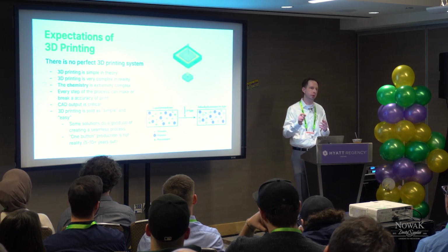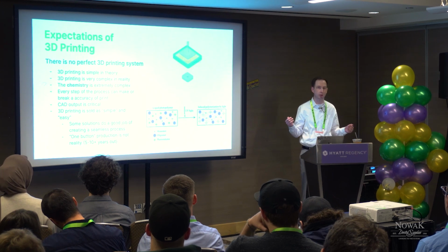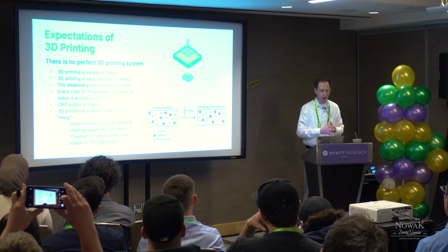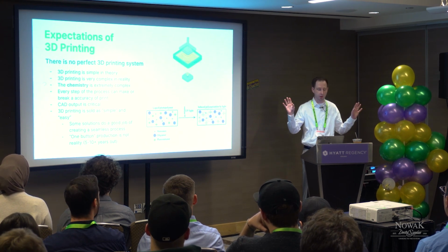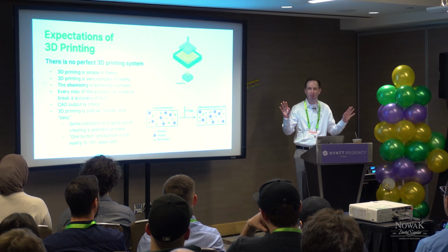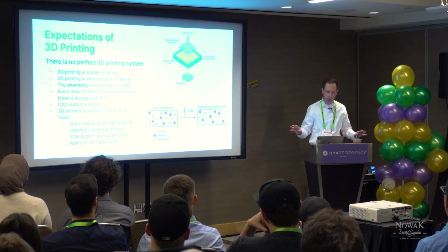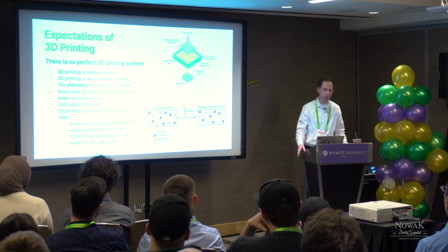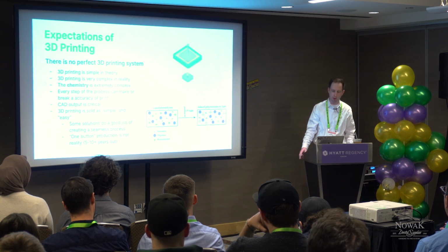Having the right wall thickness, solid versus removable dies, articulator backings. Good CAD makes good production, period. And 3D printing is generally sold, and you'll see here I have no skin in the game, I don't care anymore, right? It is sold as simple. Look at all these beautiful machines, just bum, bum, bum. Look into the details. Look at their specific instructions, what they have online. Because there are some that have a pretty good seamless process, but the devil is definitely in the details here.